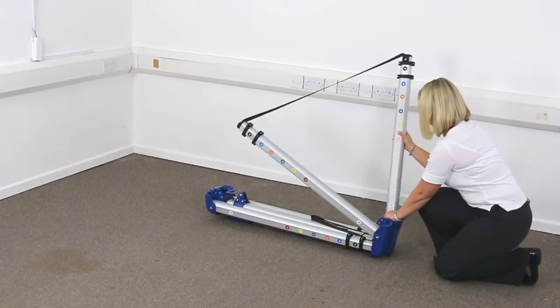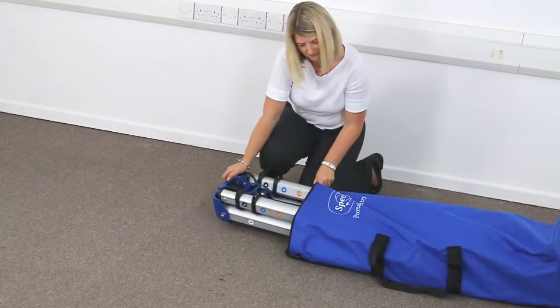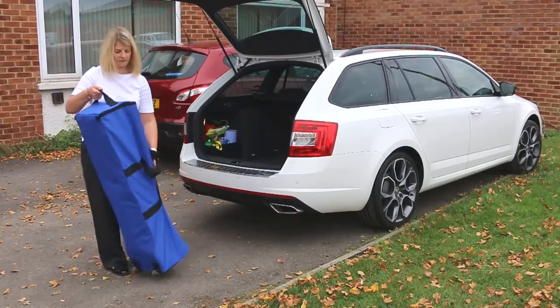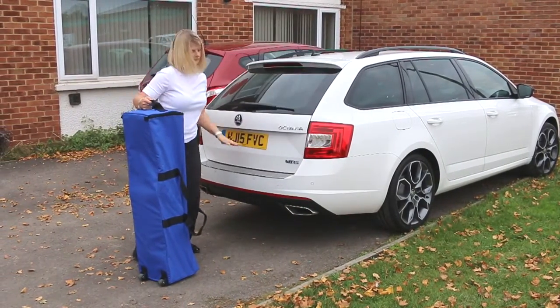Constructed from lightweight aluminium and fully collapsible, the folded gantry fits into a compact wheeled bag for easy storage and transportation, and fits comfortably into the boot of a medium-sized car.